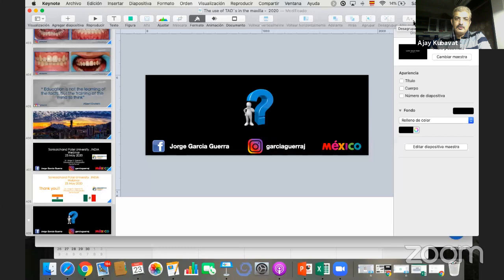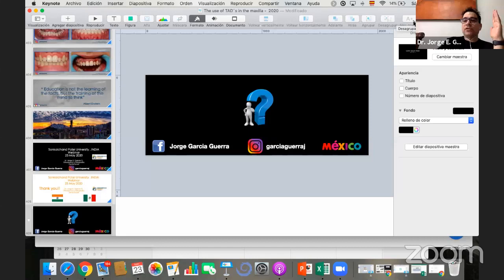Okay. Dr. Mithali Sharma is asking, with the lever arm that was used to bring canines occlusally, would the molars be intruded by reciprocal force? No, because I was anchored only on the mini implant. I tried once to do that with a transpalatal arch directly to the band of the molar, and what happened was that the molar moved. So that's why it's recommended to use a mini implant skeletal anchorage, because you're outside of the root and you're only doing the movement of the canine to the buccal. It's easy, right? Like that.